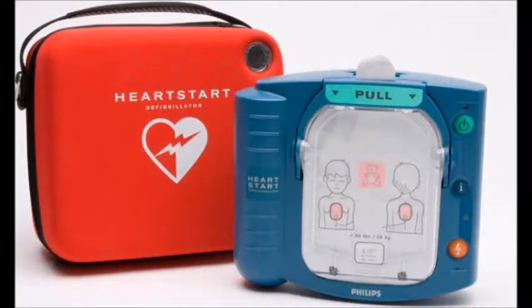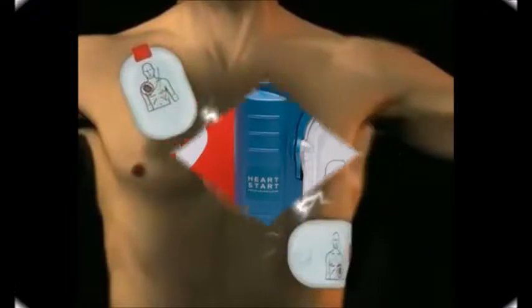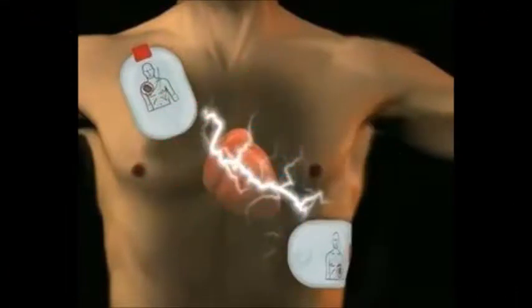In this video, the design and visualization of a defibrillator was developed. The main function of a defibrillator is to restore the electrical activity of the heart by means of an energy discharge. In this case, there were three pathologies: ventricular fibrillation, tachycardia, and bradycardia.